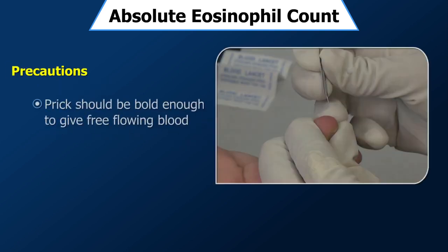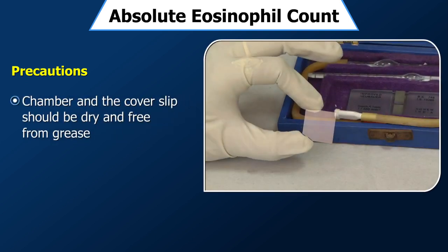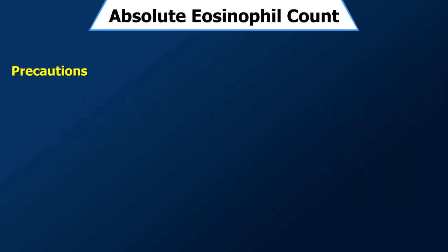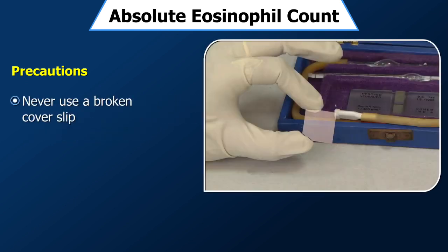Precautions: Pricks should be bold enough to give free-flowing blood. At no stage should the finger be squeezed to draw out blood. Both the chamber and cover slip should be dry and free from grease. Use only a dry pipette. Never use a broken cover slip.